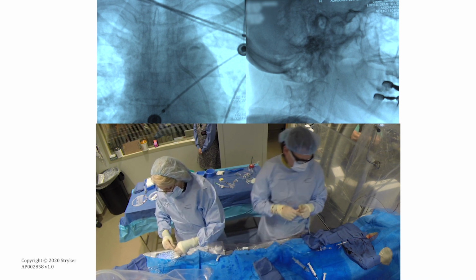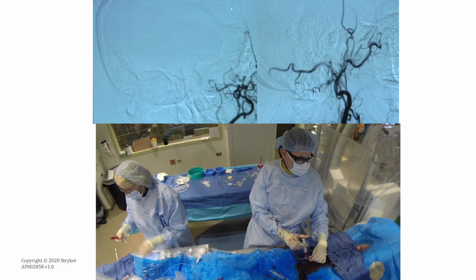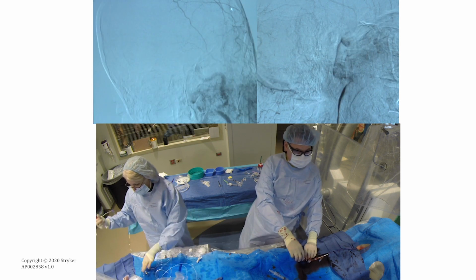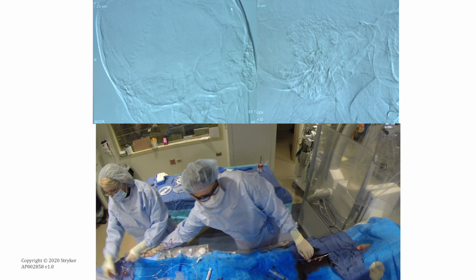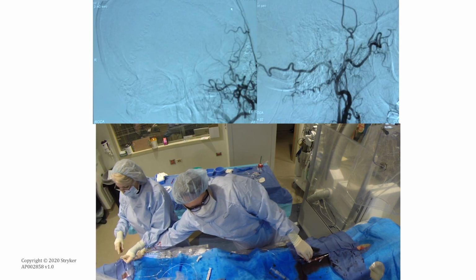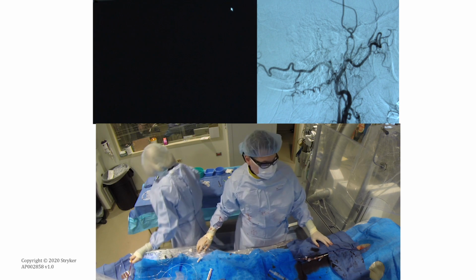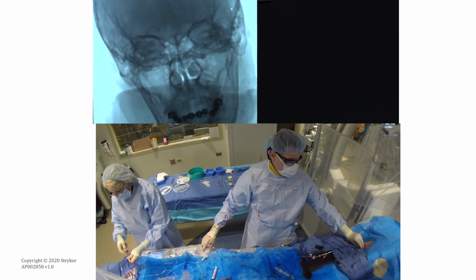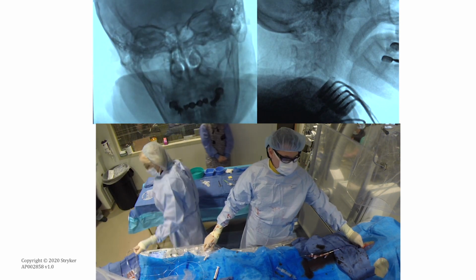The setup from here on will determine the approach. In this case, as you can see, there is a pretty significant circulation compromise, but there is flow through the bifurcation, so it seems to be mainly an intracranial problem. You can assess the anatomy of the cavernous carotid artery, and that helps us decide what type of intermediate catheter to use.